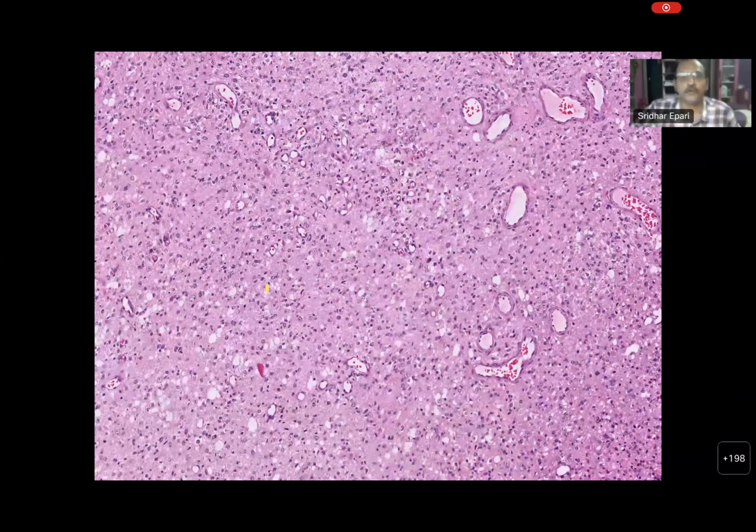So when you want to call microvascular proliferation, what Abhinami told is only one component of it. You need to have an increased number of layers of endothelial cells, at least more than 2 layers, compromising the luminal space, and the endothelial cells should be plump. The glomeruloid is only one spectrum of microvascular proliferation, and endothelial proliferation is also one component of it. You can have tunica medial proliferation, you can have adventitial proliferation. All these features together encompass microvascular proliferation.